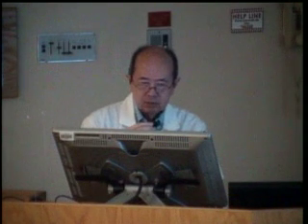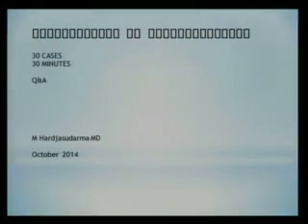What I'm going to present is a combination of MRI with CT and whatever modality is appropriate. Rather than making this a stiff academic exercise, I thought I was going to present 30 cases which are to some extent appropriate for their category in neuroradiology. It should take me about 30 minutes or maybe 40 minutes, and then question and answer. In the meantime, if you have a question during the lecture, just let me know.